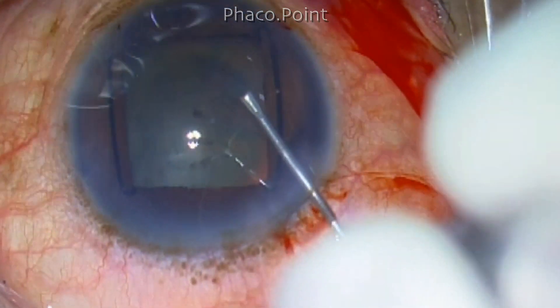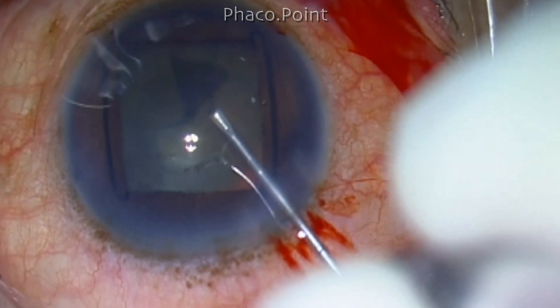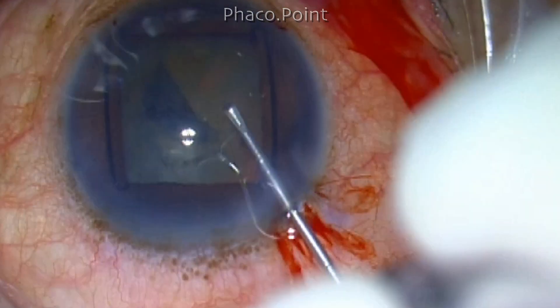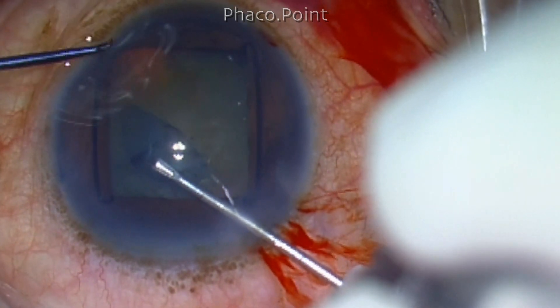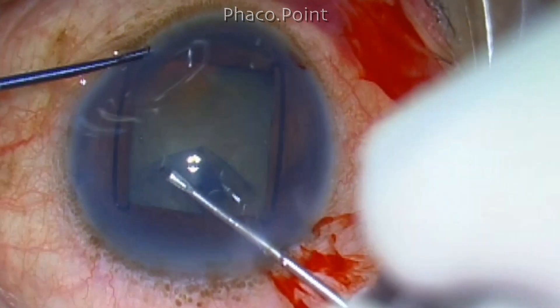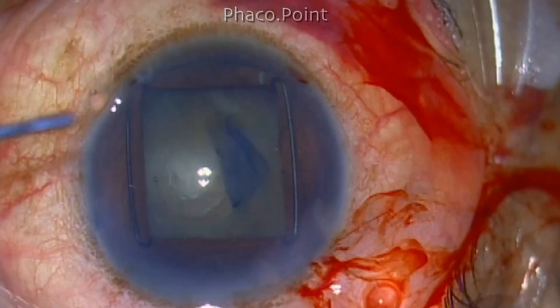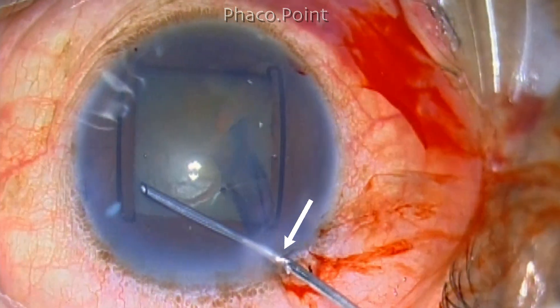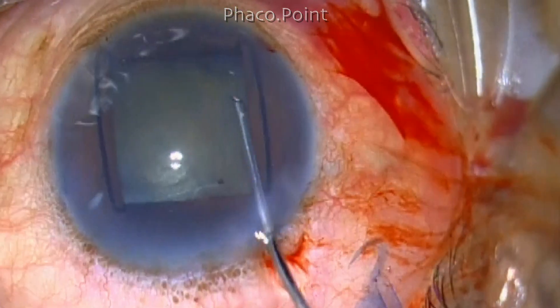The capsulorhexis is then performed. One word of caution while implanting the Gupta ring — which is a mimic of the Malyugin ring, though loading differs slightly: the loop of the Gupta ring should not lie underneath the clear corneal incision, as it is in this case. An adequately sized capsulorhexis is easily created when the pupil is nicely dilated in this diamond configuration.